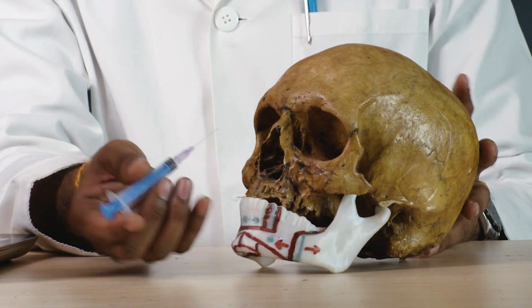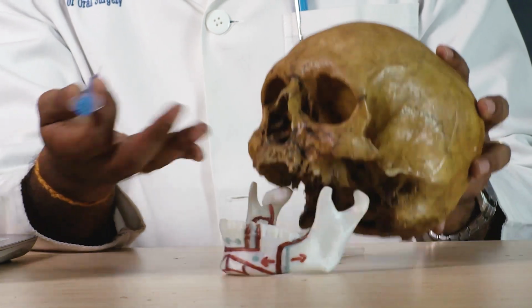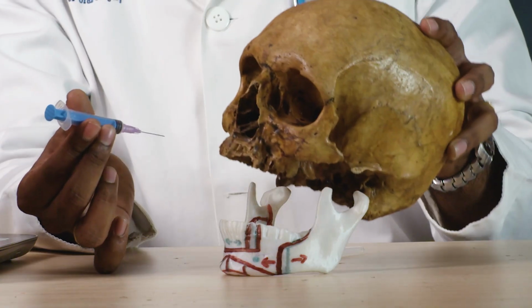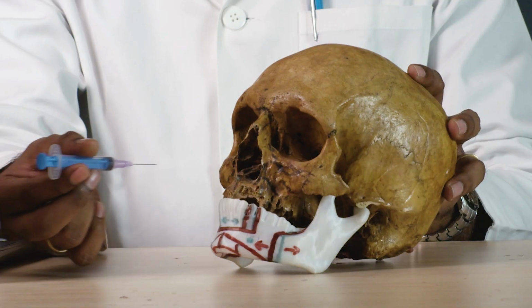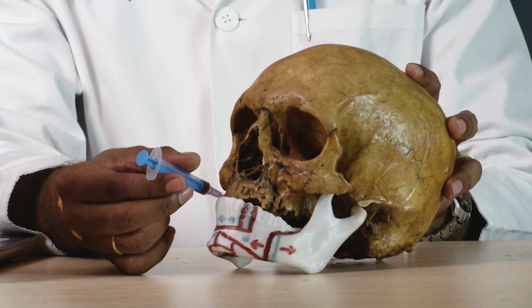So, in this situation, the needle has to be placed parallel to maxillary occlusal plane. The orientation of bevel is being critical. It has to be placed medial away from the bone, means towards the midline.